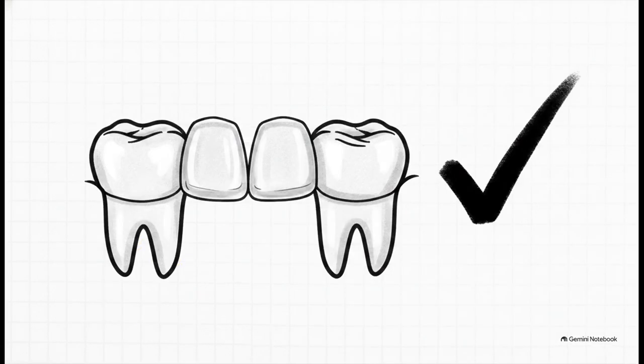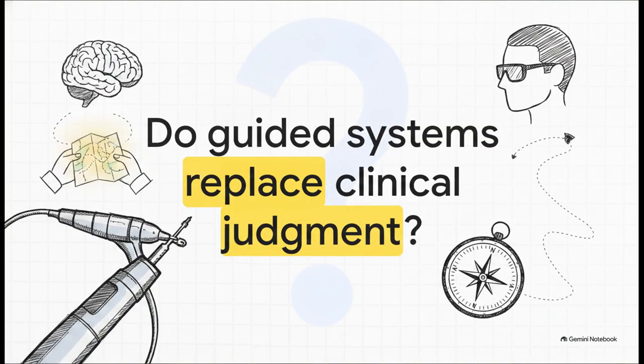It's super important to remember that newer doesn't automatically mean the old way is obsolete. If you're looking at a straightforward single-tooth case with plenty of bone and tons of anatomical clearance, the tactile traditional approach can absolutely still give you perfect clinical outcomes. In those ideal scenarios, the physical, hands-on methodology of a traditional guide remains incredibly effective and totally relevant to modern practice. We're going to wrap up this explainer with a vital reminder directly from the source material.